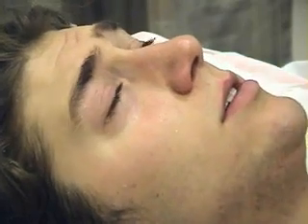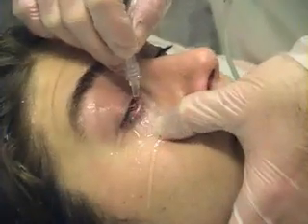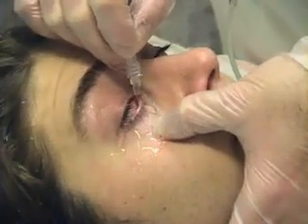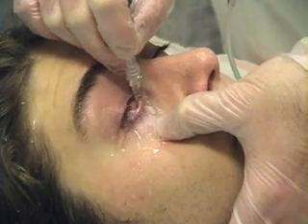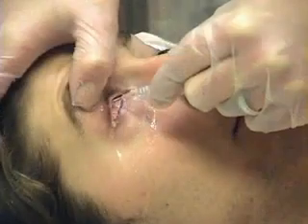The patient may require additional topical anesthetic during the irrigation procedure. The patient presented in this video sustained a chemical splash to both eyes, so the irrigation process was repeated on the opposite eye.